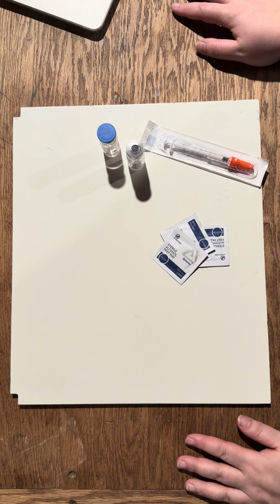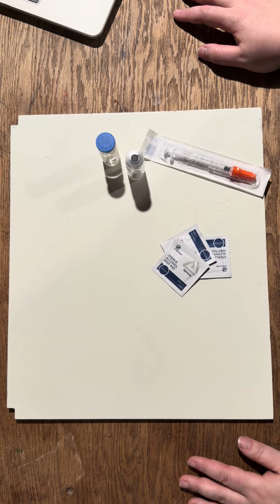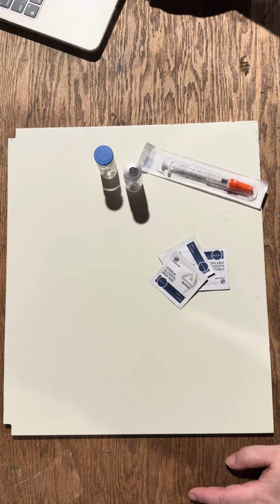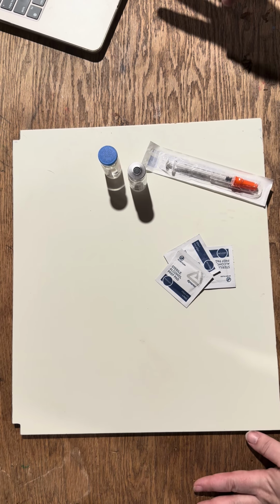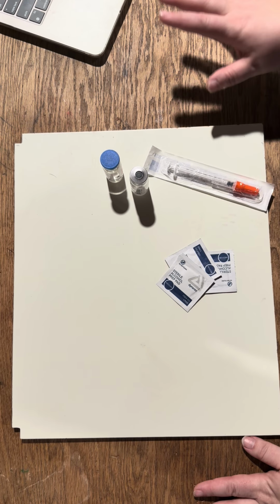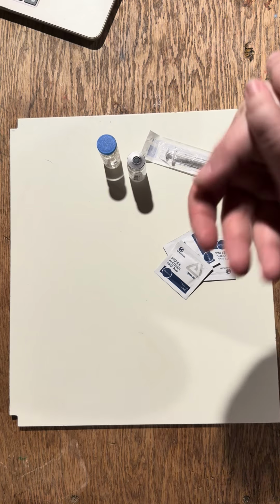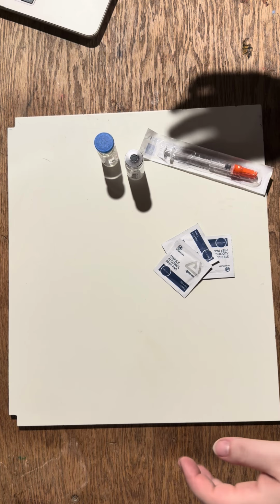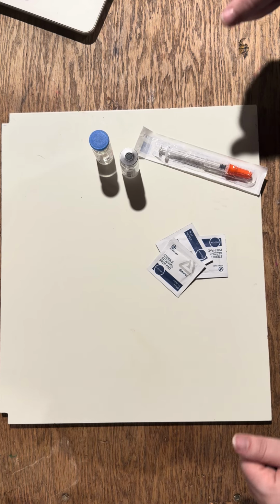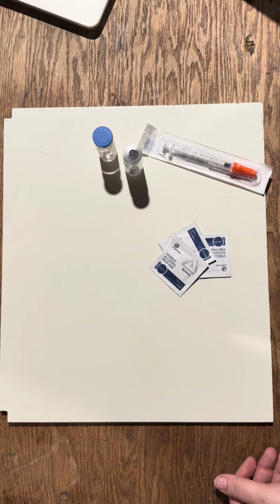I'll be giving a mixed dose of insulin today per my EMR. I have my patient, Tony Kirkland, and I verified the orders in the EMR. I would walk into the room, perform hygiene, introduce myself. I would have my patient identify themselves with 2 patient identifiers, name and date of birth.